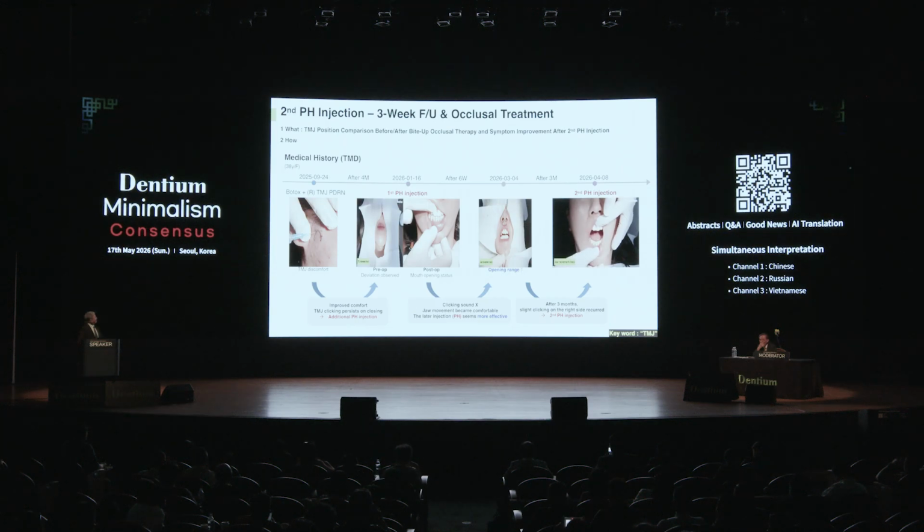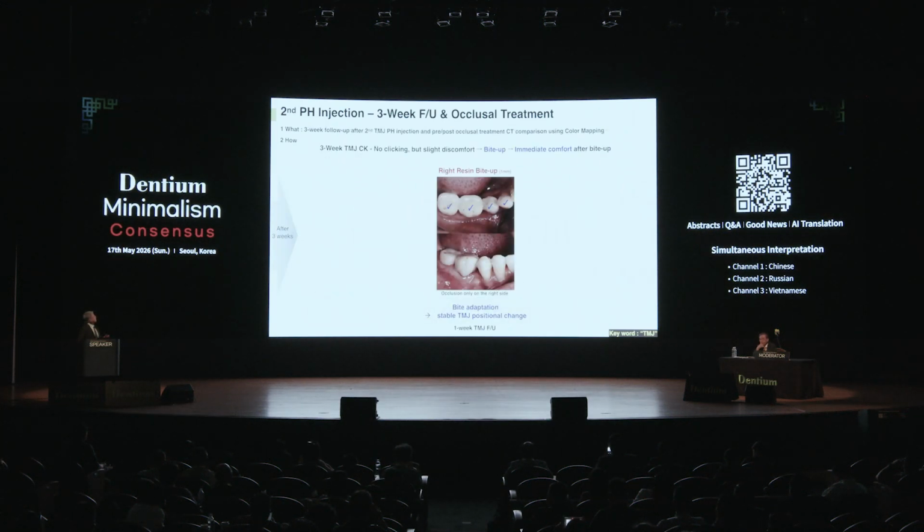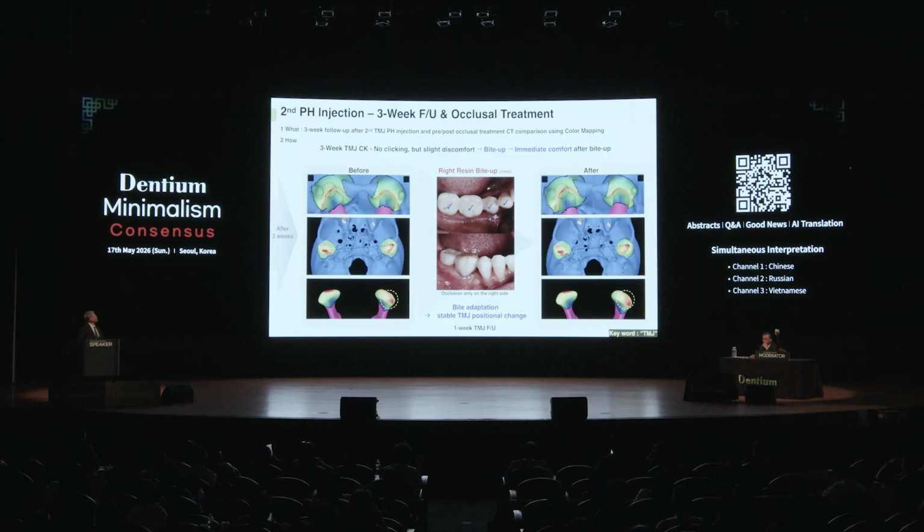So another interesting approach of ours is bite increase only on one side, especially the first and second molar. From time to time, at first after the increase the contact area is only on one side, but during the follow-up we came to know there is a bilateral contact. The patient's jaw is a little bit tilted or rotated, and in this CT image it is a little difficult to define, but we can feel that some gaps became opened.